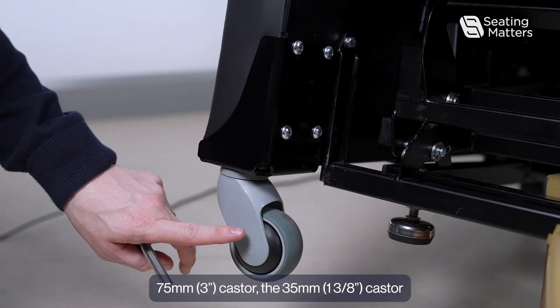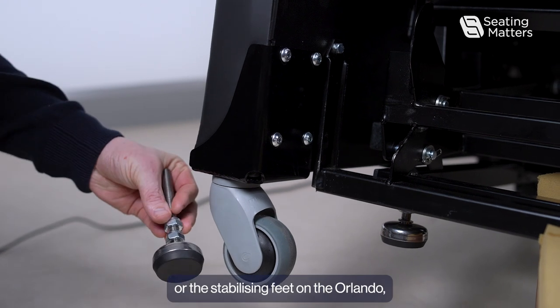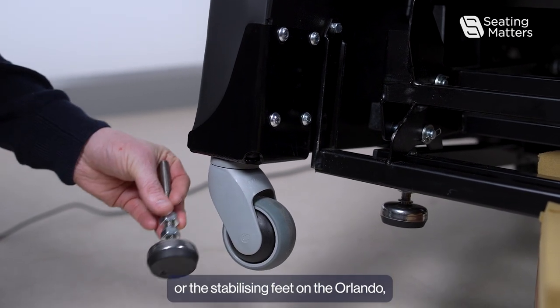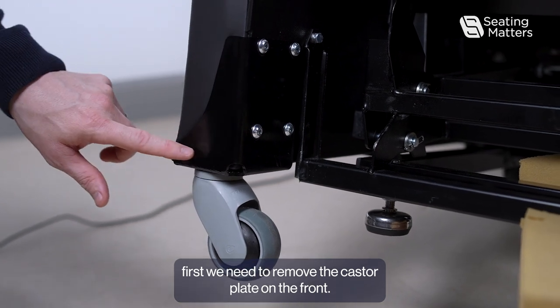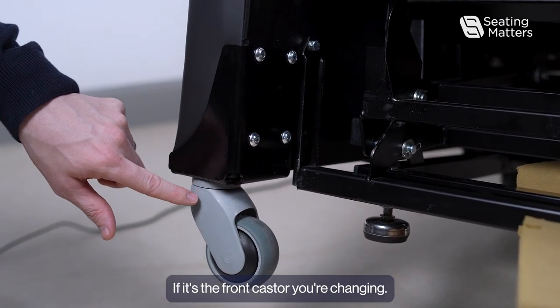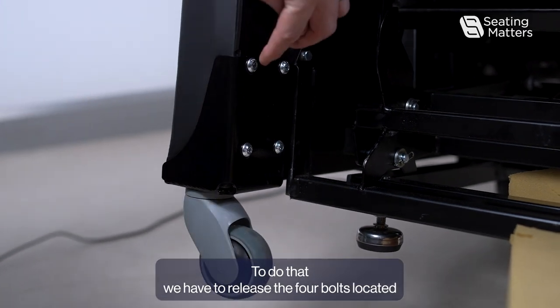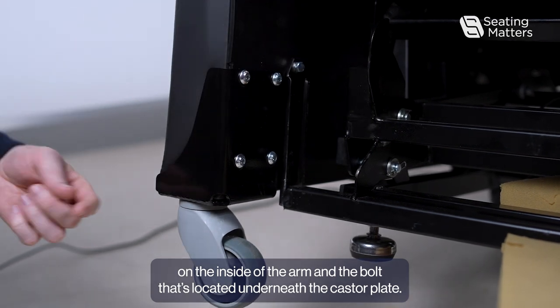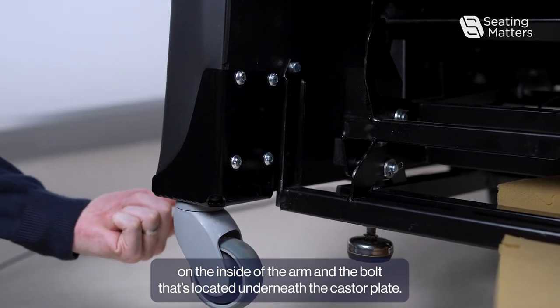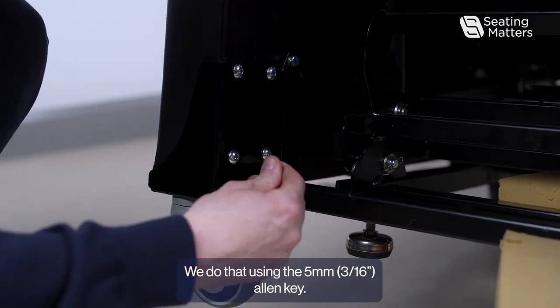To replace either the 75mm caster, the 35mm caster, or the stabilizing feet on the Orlando, first we need to remove the caster plate on the front, if it's the front caster you're changing. To do that, we have to release the four bolts located on the inside of the arm and the bolt located underneath the caster plate, using the 5mm Allen key.